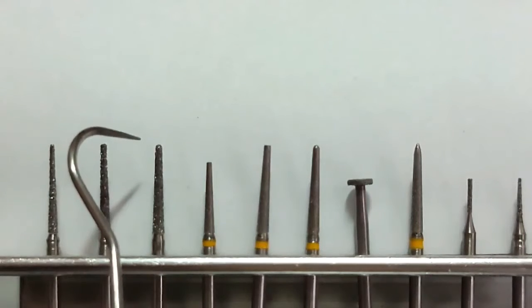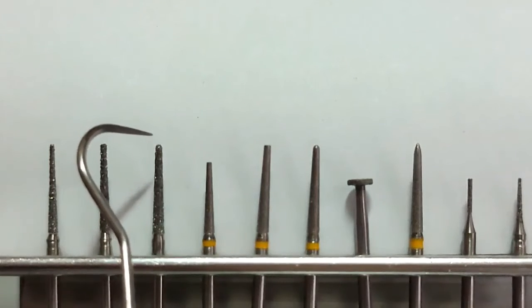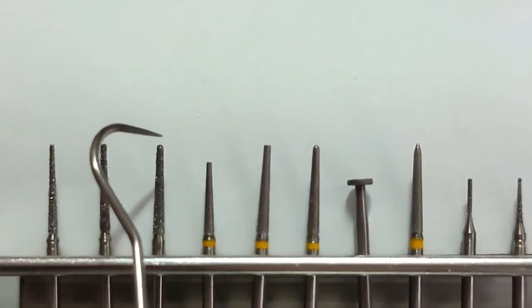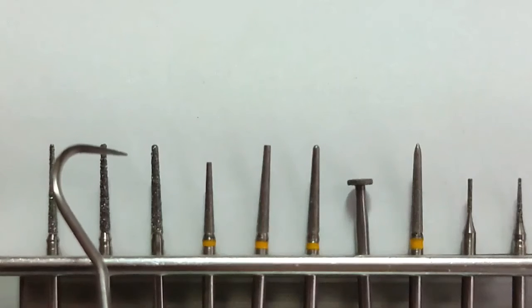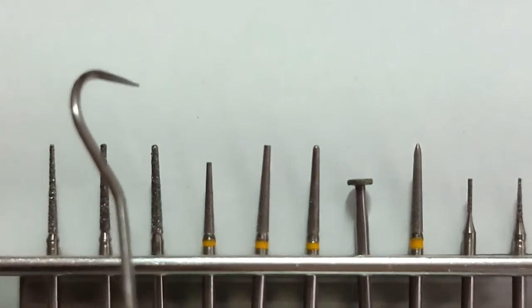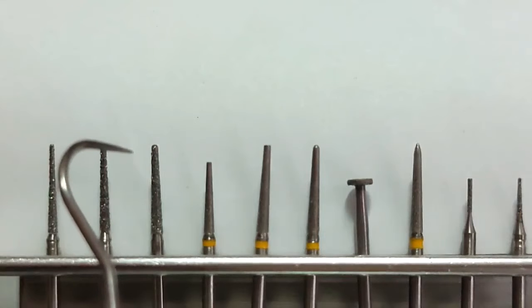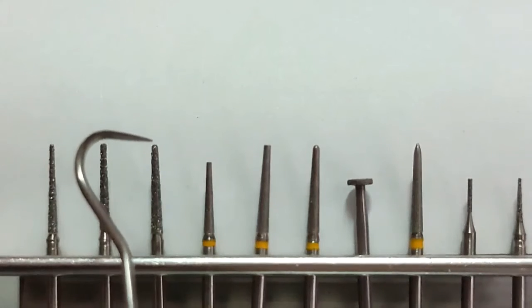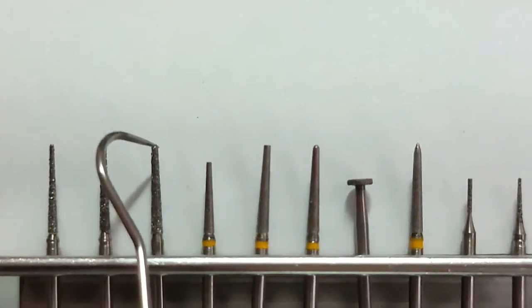And then after that, you have your chamfer. I prefer to use a round end, but hindi ko siya dinidepen all throughout the tip of the burr. Ginagawa ko for premolars, almost half or more than half. And then for the molars, at least nasa two-thirds of the depth and the tip of the burr para magkakaroon siya ng chamfer. May iba torpedo, but hindi ako na confident sa torpedo kasi I can see na medyo nagkakaroon siya ng feather edge finish instead of chamfer. So, mas kita yung chamfer preparation when you use a round end na burr.